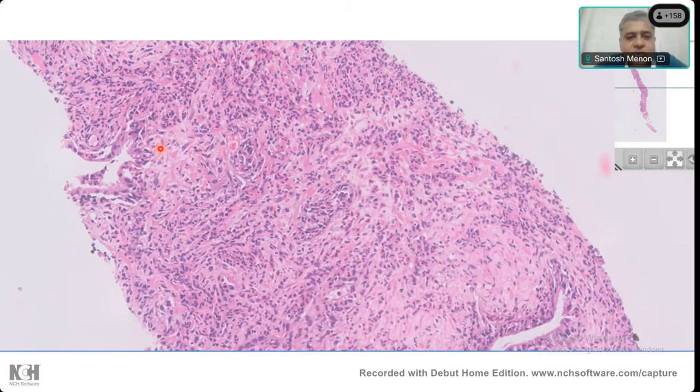So what do you think? Is this a benign gland or malignant? Anybody? Malignant. This one is malignant? The longest gland with, you say, the rigid lumen, maybe not. What do you see in the background here? Are there tumor cells? Are there inflammatory cells? More inflammation. You can see better here.